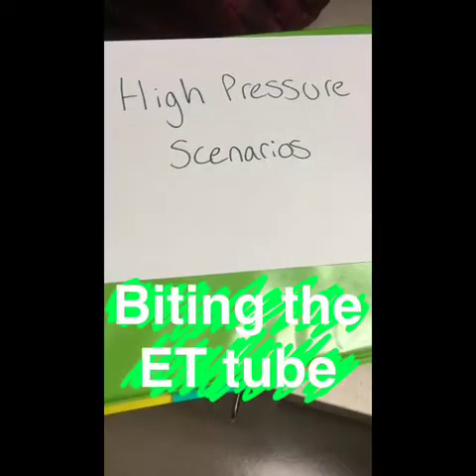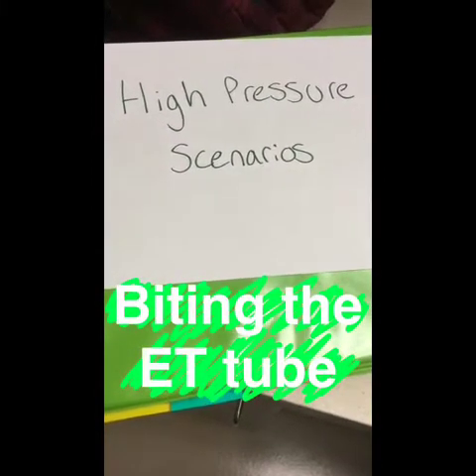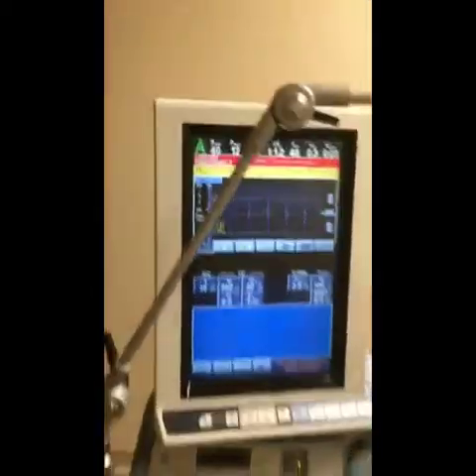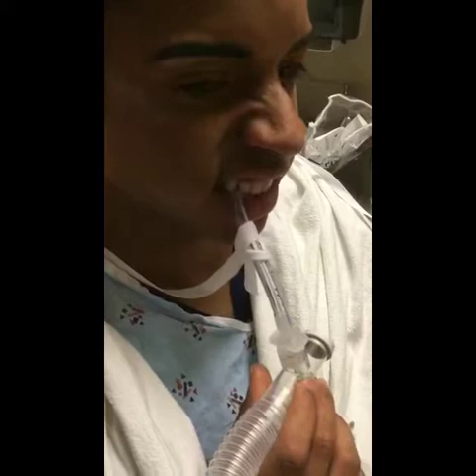Excuse me, will you please come to room 233? The patient's ventilator will not stop alarming. Wow, those are high peak pressures. Oh yeah, he's definitely biting through that ET tube.